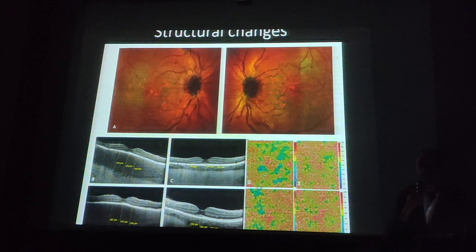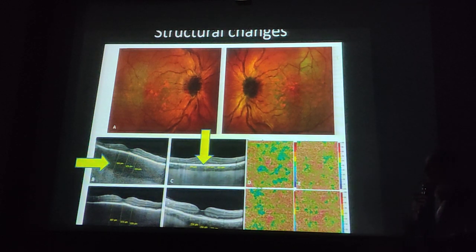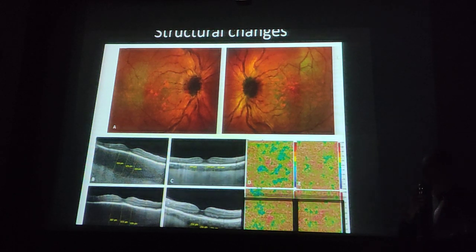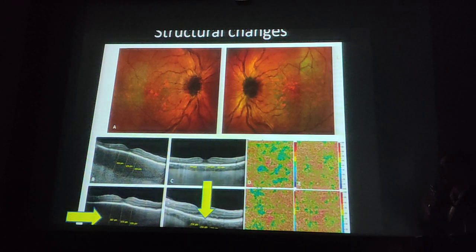these. This is a multicolor picture of both eyes of a patient with active VKH. This scan shows you the thickened choroid during activity and then how it's thinned during remission. The choriocapillaris density map shows you what we were talking about: less flow, more green and more blue, so there is less perfusion during activity, and then more red and green and orange during remission, so there is more flow. And the same was seen in the left eye, again, less thickness and more flow.